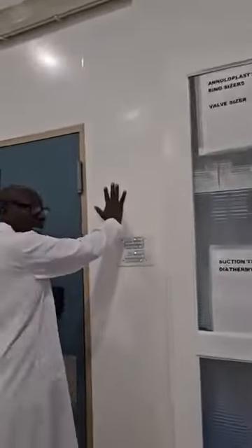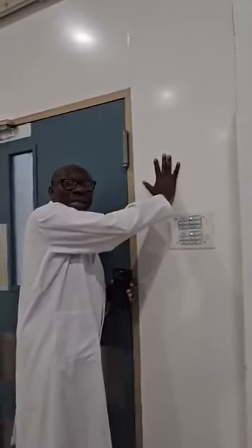It's a company from Canada that came and did it, called Damtrack. If I place my hand here for 30 seconds, 99.95% of the bacteria in my hand will be dead. So this is an extremely clean room. And then you have all these UV lights. For surgery, we turn them on.